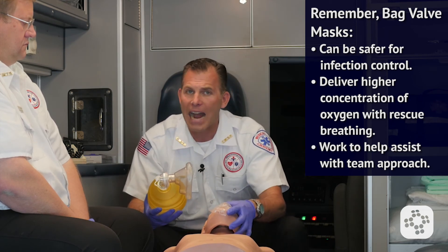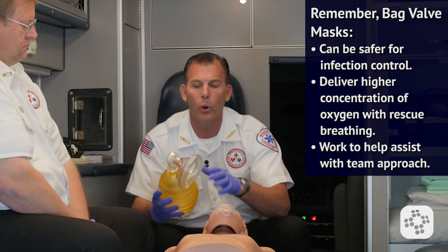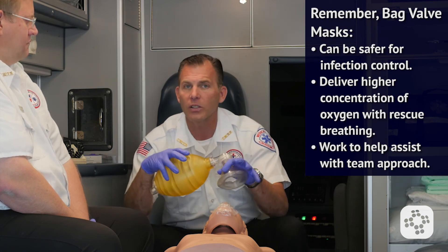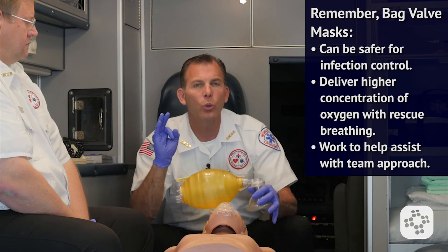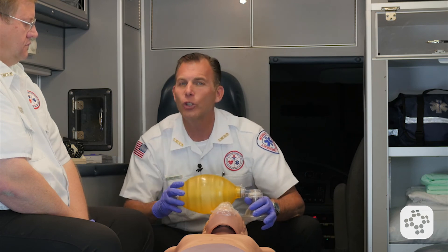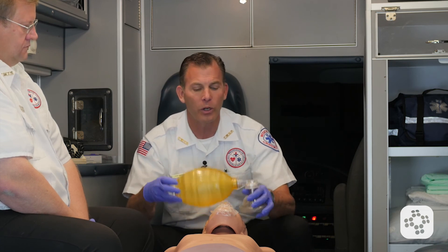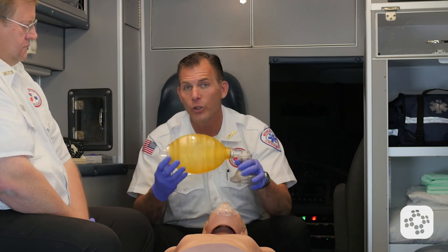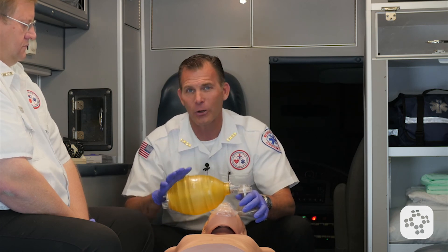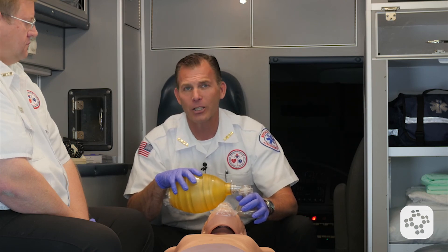The patient is going to become anoxic — they'll run out of oxygen — and we'll be doing more harm than good. If your protocols state to use a bag valve mask, it's a tool you simply have to practice with. I believe everybody can get proficient with it, but not without practice. If you're supposed to use one or see the benefits of using a bag valve mask, get your mannequin out, get your bag valve mask out, and start practicing so you can become a well-versed rescuer in airway management.